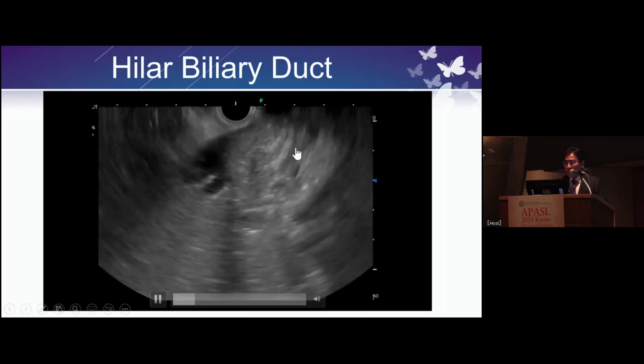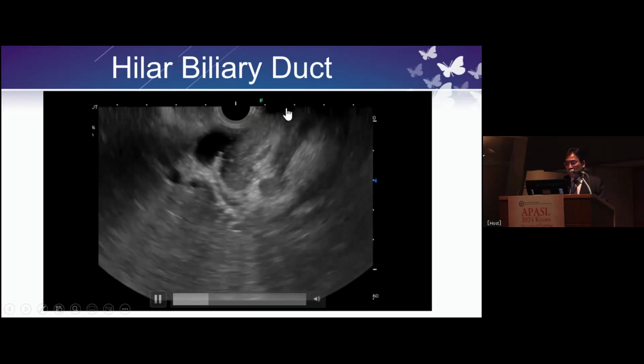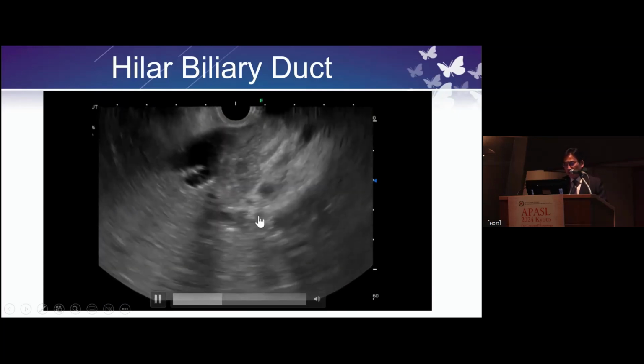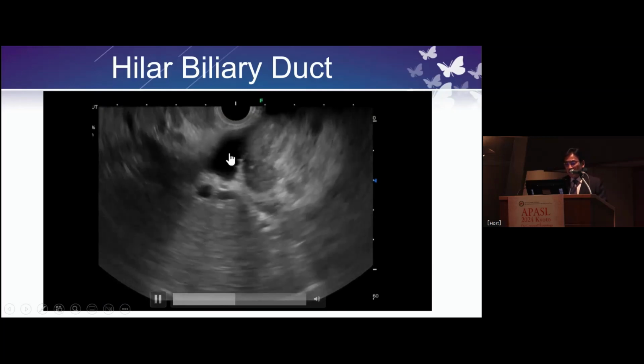Just visualize, no intervention, just visualize. This is the extrahepatic bile duct and the left hepatic vein. Left hepatic duct. This is a segment, this is a portal vein.